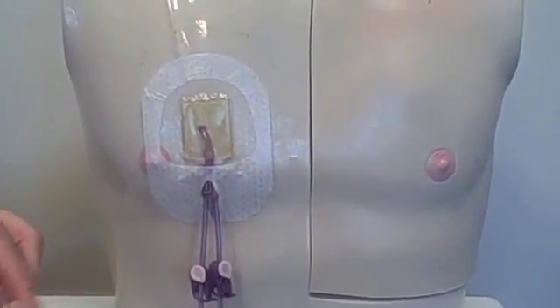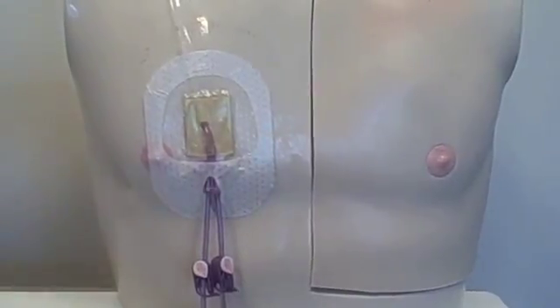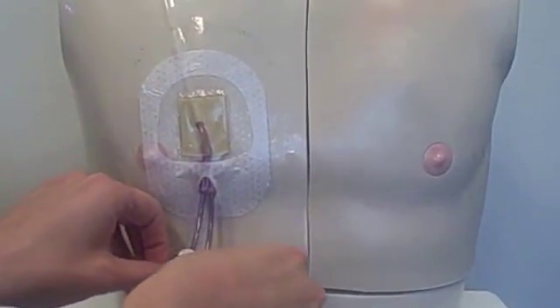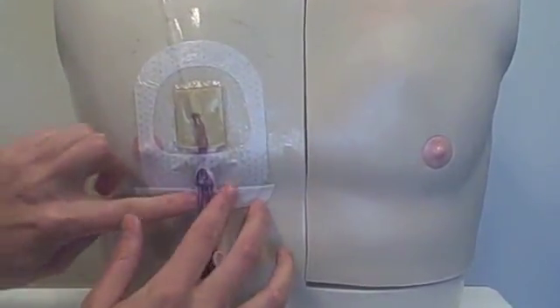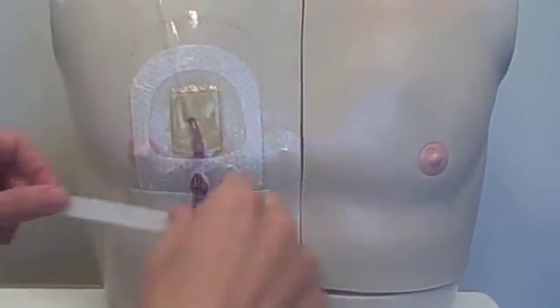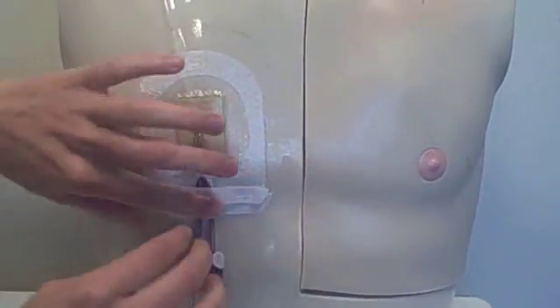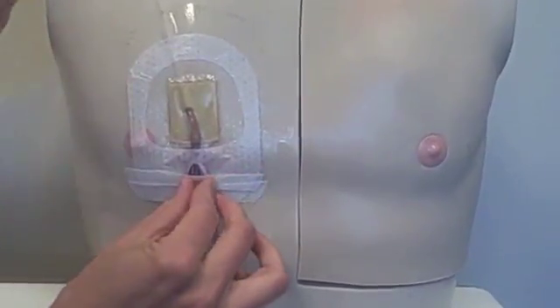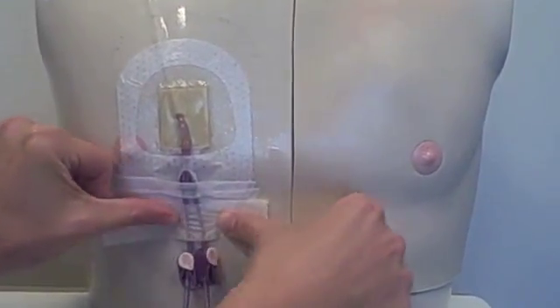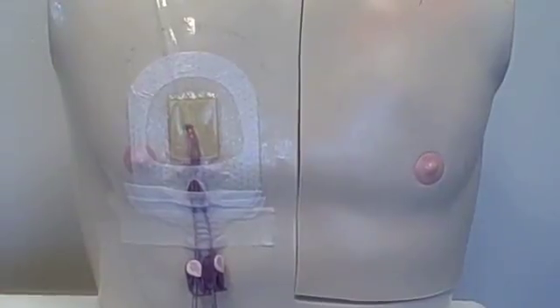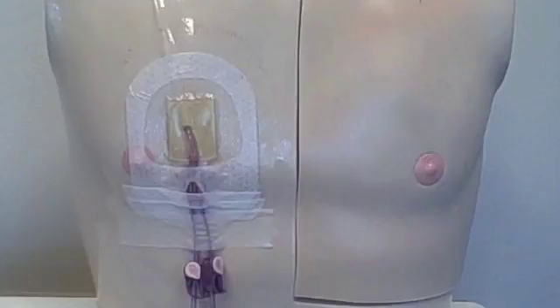Then remove the pre-cut paper tape strips from the frame and use them to further secure the dressing, placing one under the lumens on the bottom of the dressing and one on top of the lumens. If needed, you can secure the catheter to the chest with paper tape to prevent it from being pulled or tugged. Tear off one or two pieces of the perforated tape and apply it to the bottom of the dressing. Place it over the notch where the tails come out of the dressing. The dressing change is now complete.